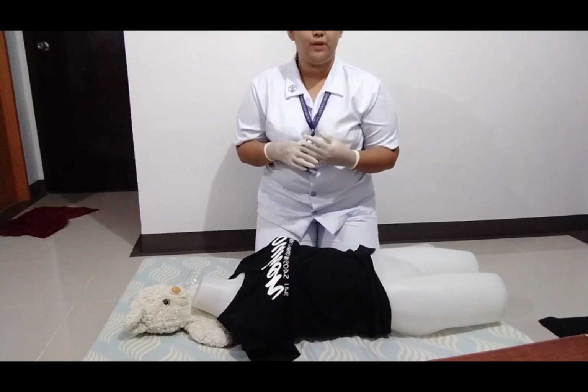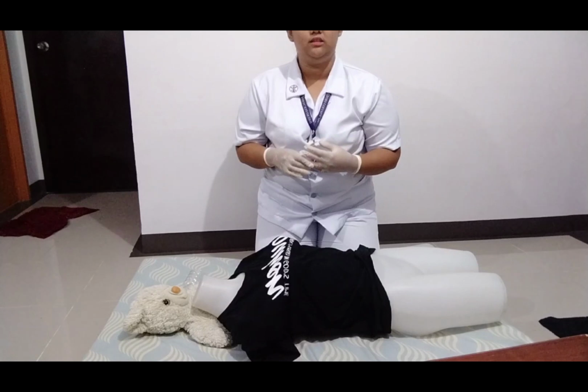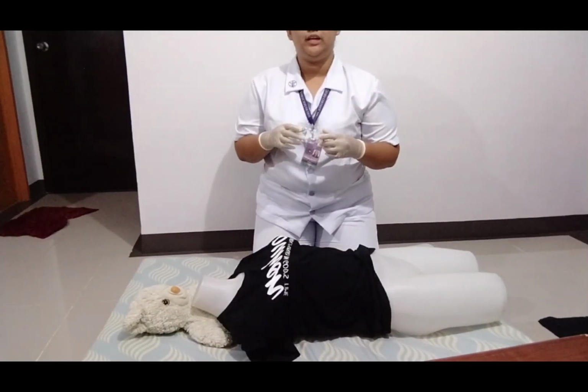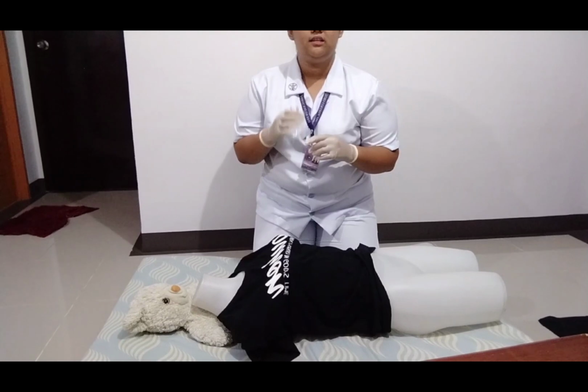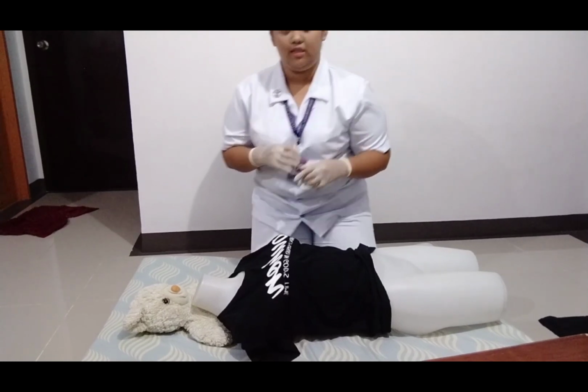After doing the chest compressions, immediately administer 2 rescue breaths to the patient. I am going to get my bag mask or my barrier device, and I'm going to cover the patient's mouth and nose with it, and head tilt and chin lift to open the patient's airway and deliver the rescue breath.